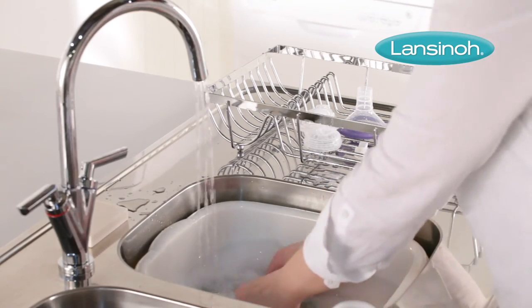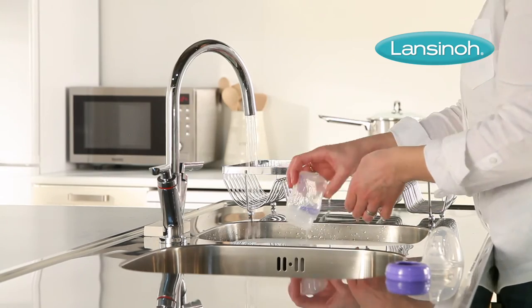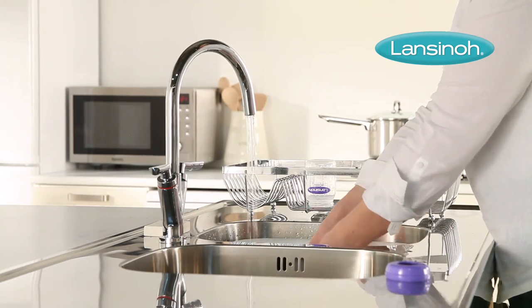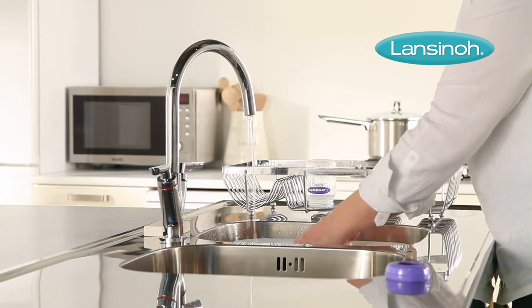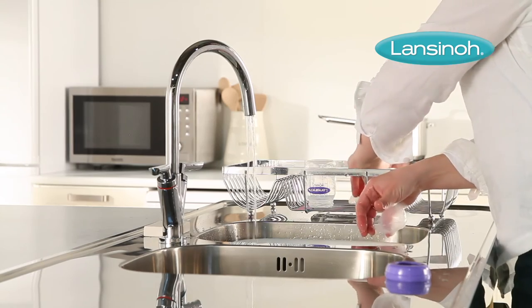The white valves, silicone diaphragms, and breast flanges are dishwasher safe. However, we recommend hand washing with warm soapy water to extend their usefulness. Make sure you completely air dry all parts on a clean towel or drying rack before assembling the pump and using it.